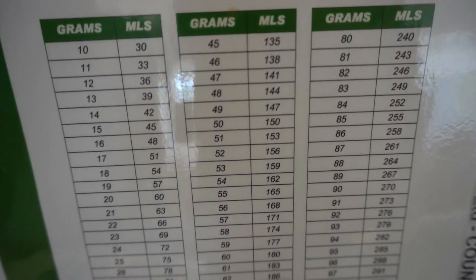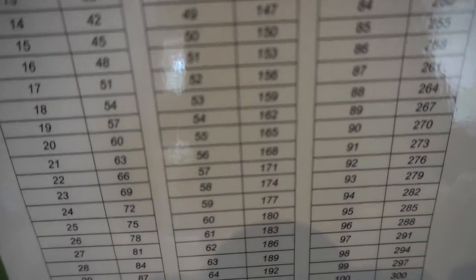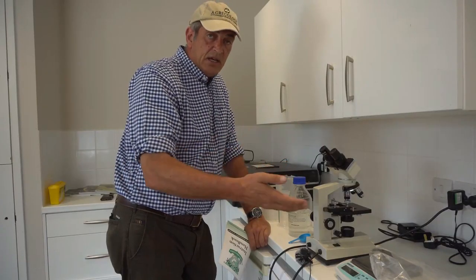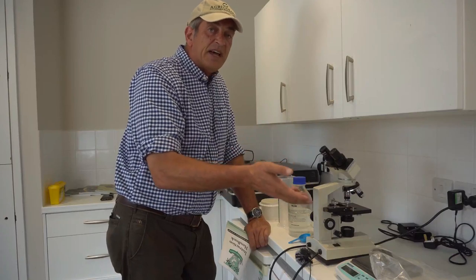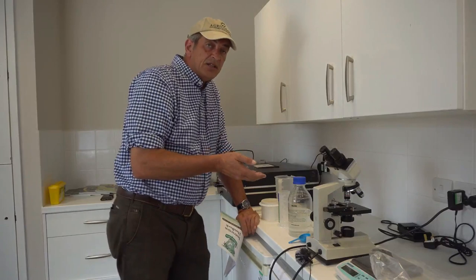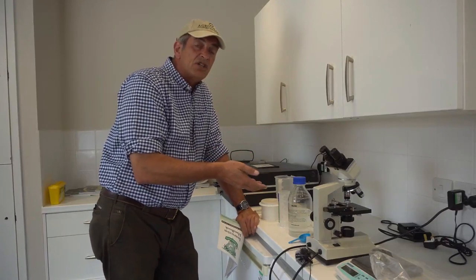You allow it to soak and mix it up very thoroughly. Then you take a sample — it's all graphed out very easily — so you take a carefully measured piece of that sample, sieve it through a sieve, and add some saline solution again at the right ratio.